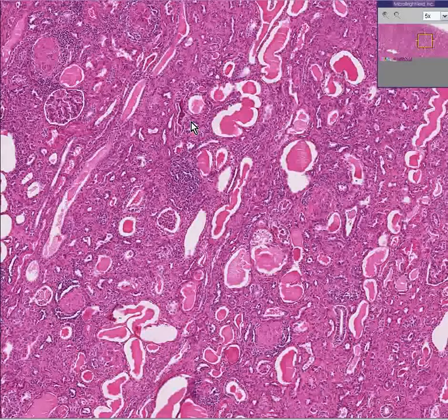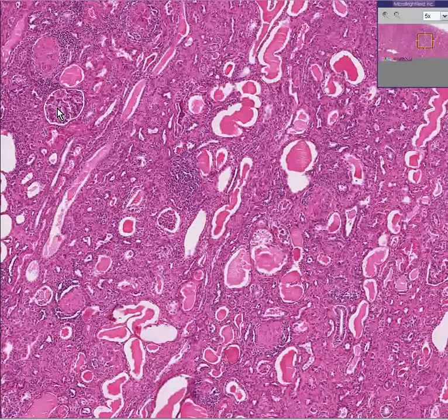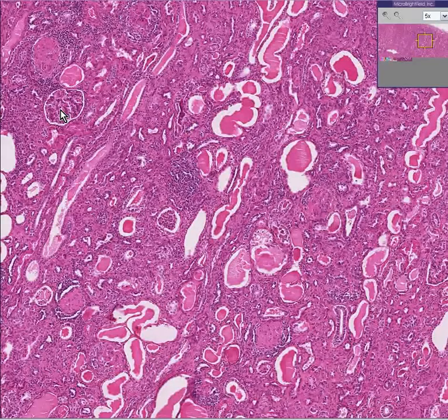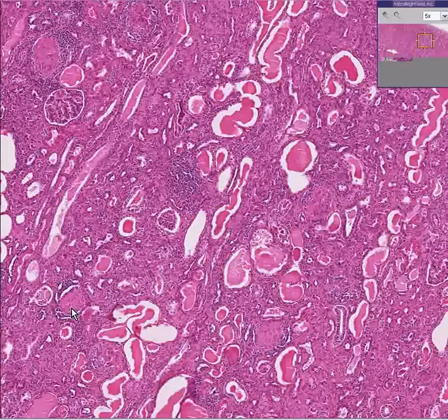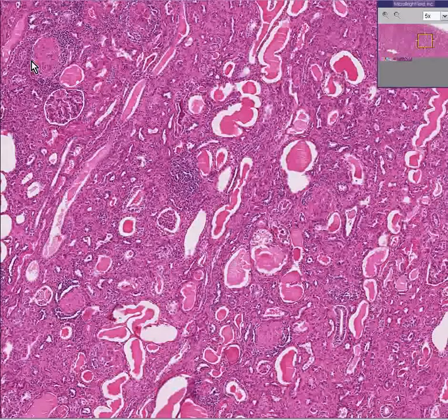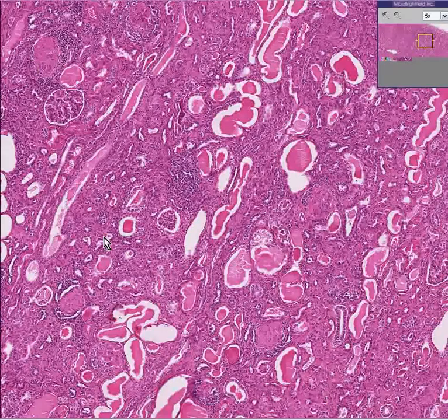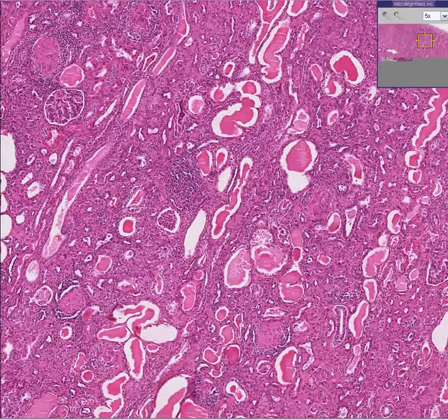Longstanding over time, due to any primary glomerulonephropathy. In this whole field, for every relatively normal-looking glomerulus you can see, there may be four or five that are abnormal. And this is not uncommon.